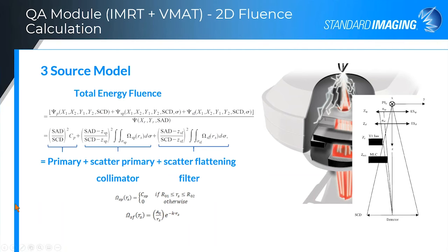And here's another figure from the Yang reference, and it shows a projection depicting a slice through the Y jaw and two of the source planes. And you can look at this from the detector eye view down here, looking up at the source.